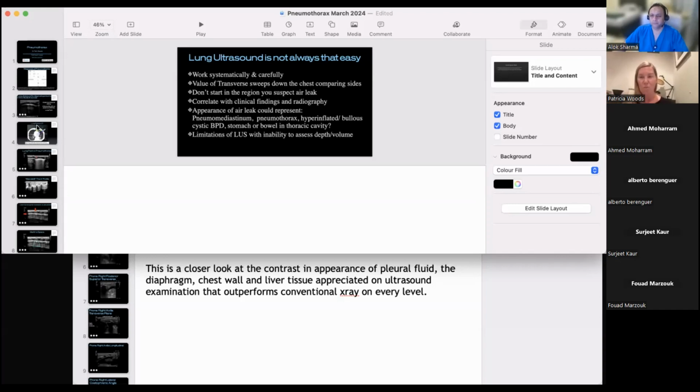As I'm sure you would with x-rays. In our unit, it is protocol to still obtain an x-ray, and that's fine. I think you have to think of your defined clinical question and then compare, and it can help colleagues understand what you're doing, what you're talking about too, and medicolegally. But I think the serial observation is helpful, and the physics is important.